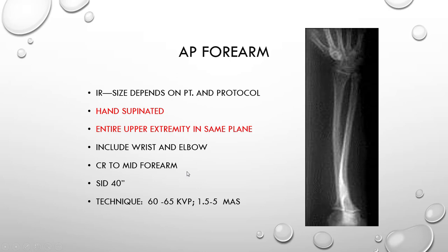You can use a half apron. Set your SID for 40 inches to tabletop. We do not use a grid or AEC. You will be selecting manual technique anywhere between 60 to 65 kVp and 1.5 to 5 mAs depending on your facility. For our purposes, we'll be using 60 kVp at 5 mAs.